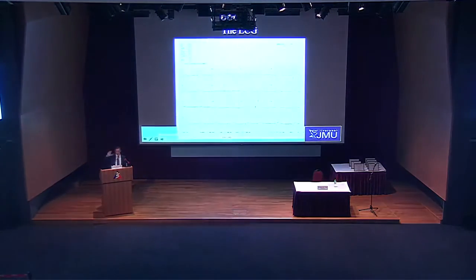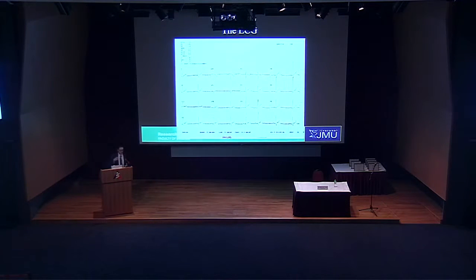I know it's a big audience, but I'm going to try and make this relatively interactive. Hands up who thinks this ECG here is normal. This is an elite athlete. Anyone who interprets ECGs? Okay, anyone think it's abnormal? Okay, anyone unsure? Okay. This is a normal ECG for an elite athlete, and you can see he's got a marked bradycardia. There's a little bit of artifact, he was a bit tense. There's first degree AV block, possibly an incomplete right bundle, slightly pushed up ST segments or early repolarization here, but this is quite normal. So this guy comes in, he's got a normal ECG.